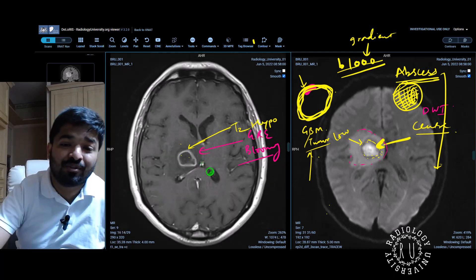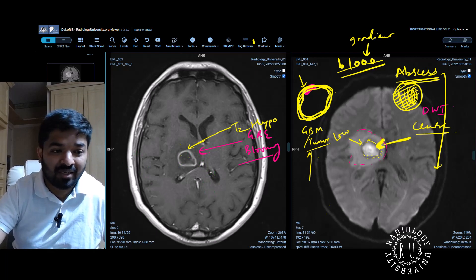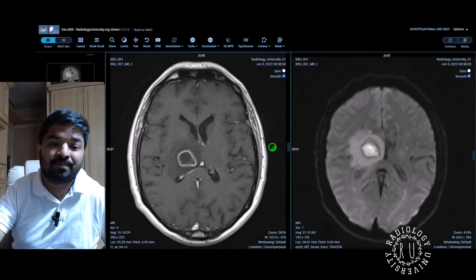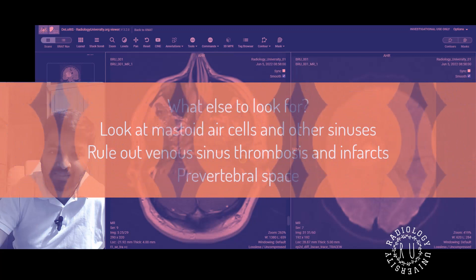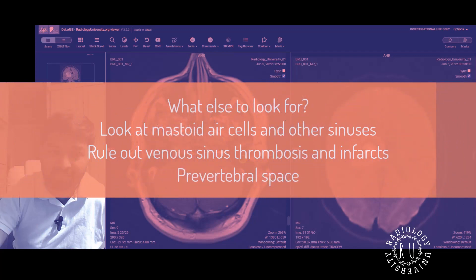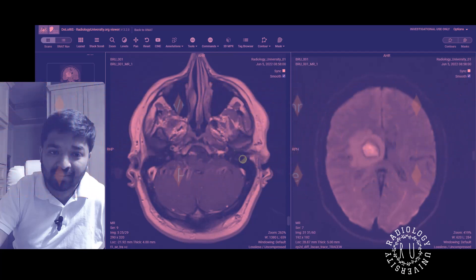What negative points should you mention? Whether there is meningeal enhancement, whether there is any other focus of abscess, and you need to look at mastoids and sinuses — whether there is mastoiditis breaching bone and causing abscess, any extracranial focus of infection in the scalp, osteomyelitis, skull base osteomyelitis, pre-vertebral abscess when scrolling down C1/C2, venous sinus thrombosis caused by the abscess, and whether there is an infarct caused by the abscess.